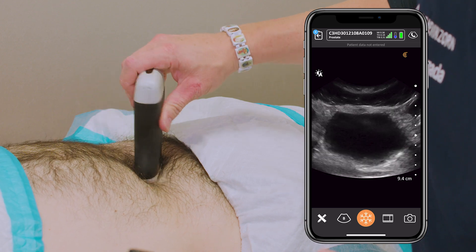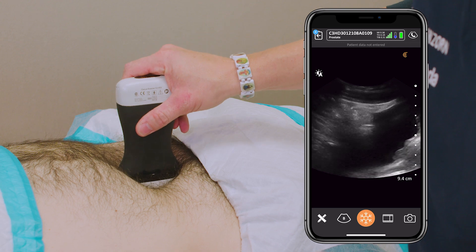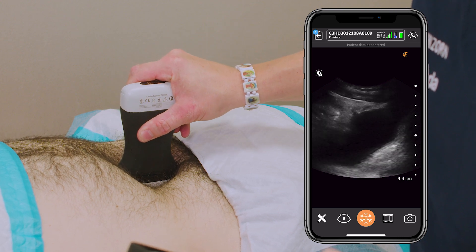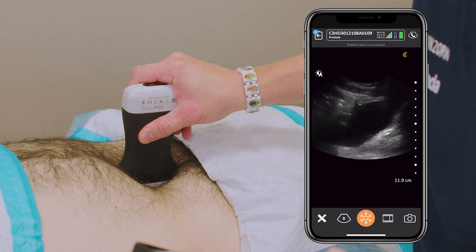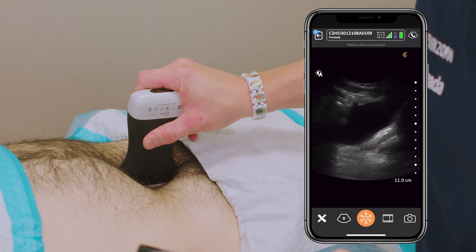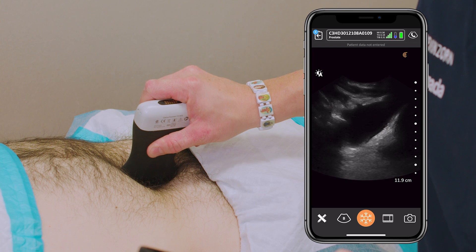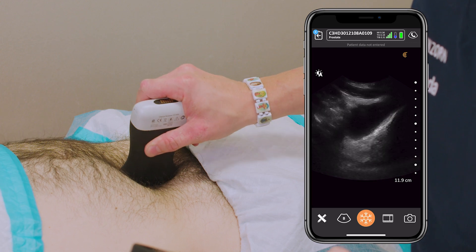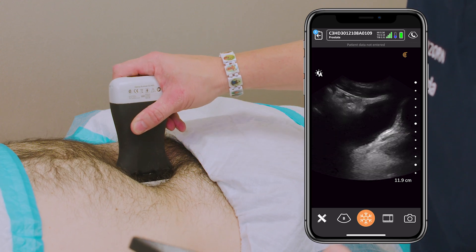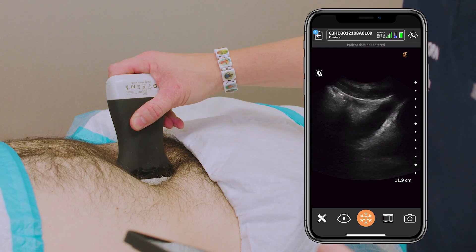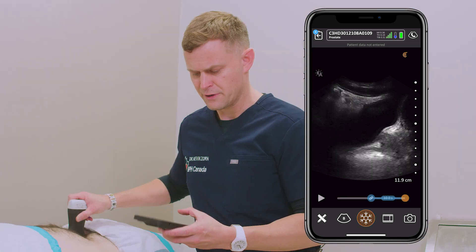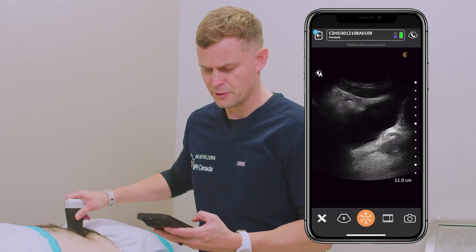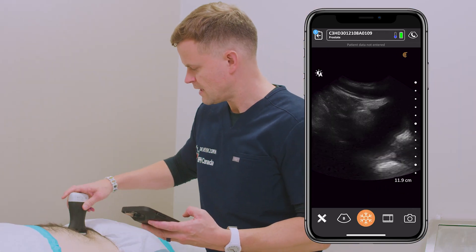We'll go sagittally and do the same views again, just making sure there's no anterior wall tumor or defect. Clearly fanning from both sides of the bladder — clearly no abnormalities. I'll go ahead and freeze and save that image — that's my sagittal view of the bladder.